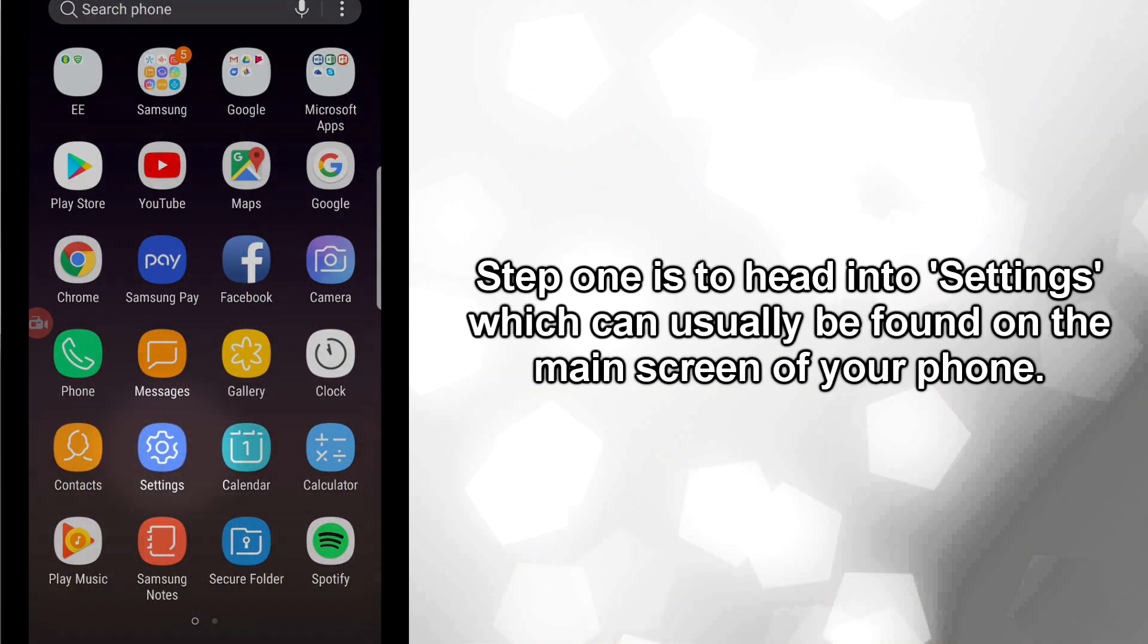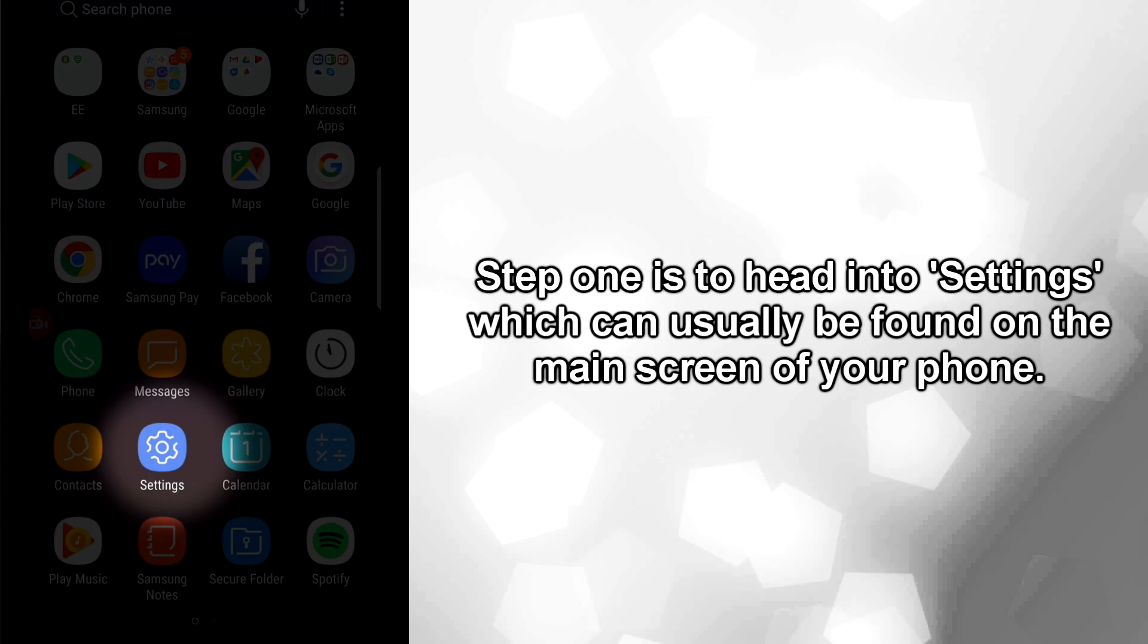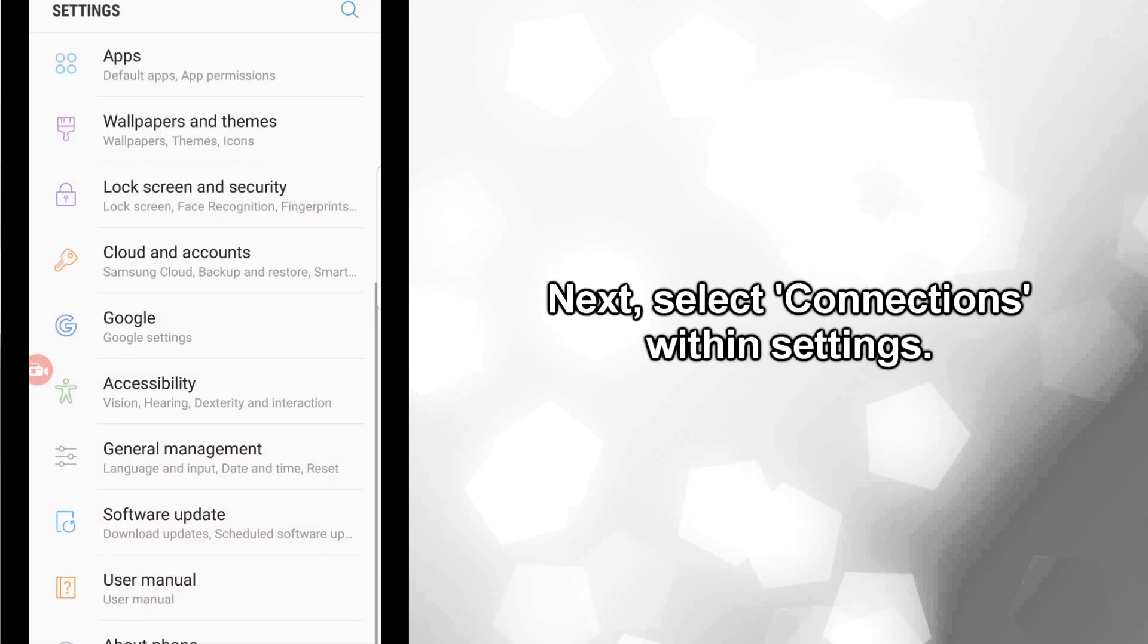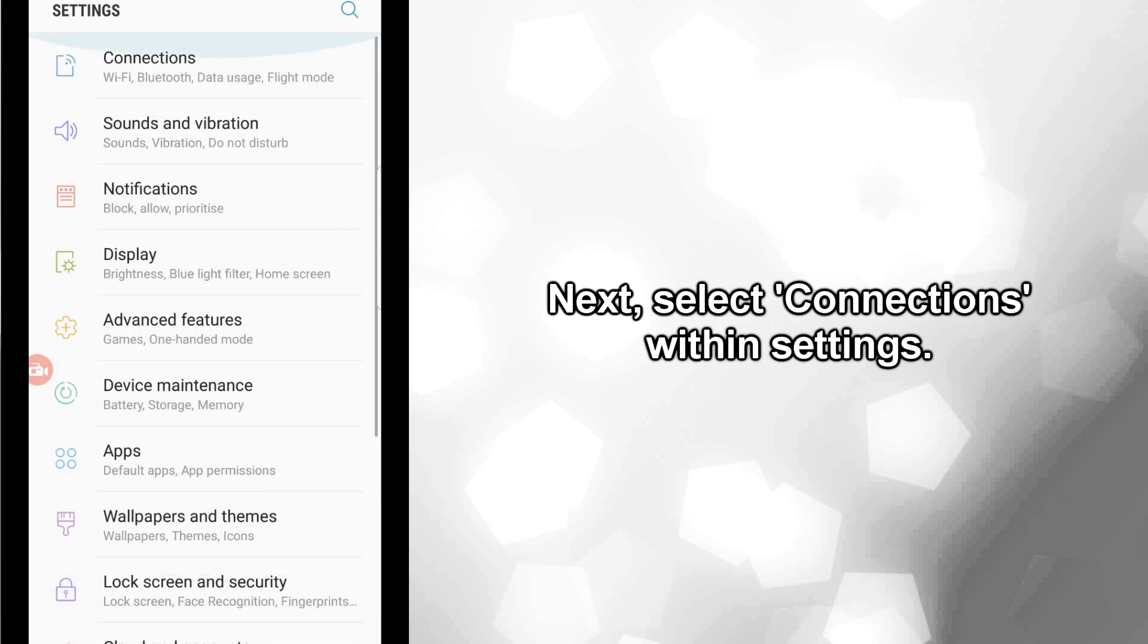Step one is to head into Settings, which can usually be found on the main screen of your phone. Next, select Connections within Settings.